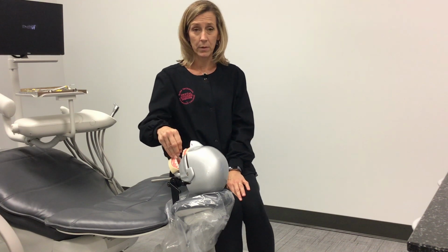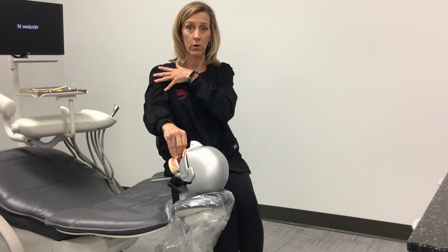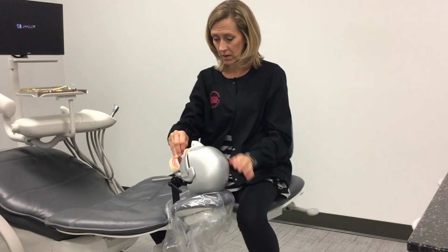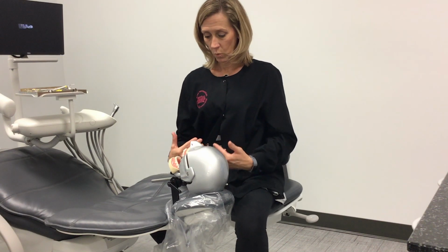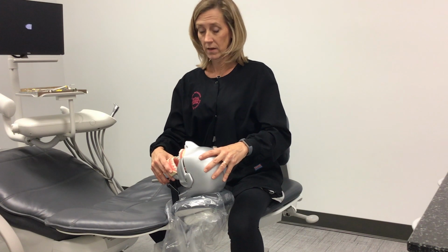It might be pushed back a little bit, or pushed a little bit further back, depending on how long your arm is. The other option is a 9 o'clock position, where you want your belly button toward the ear of the patient, and this would be the 9 o'clock position.